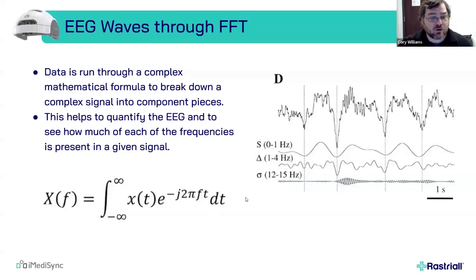So I'm sure all of you are ready for this level of mathematics. In fact, I'm joking. I don't even know how to read this. This is really complex math. But what's awesome here is this picture to the right. So this line at the very top of this picture, this line that goes up and down and dips and looks sort of jagged, that line represents a raw EEG signal, right? What we would get from one sensor placed on someone's head.